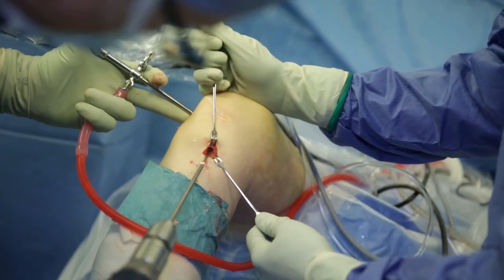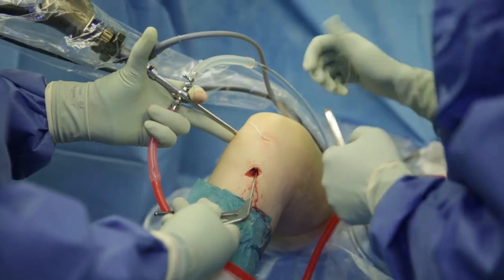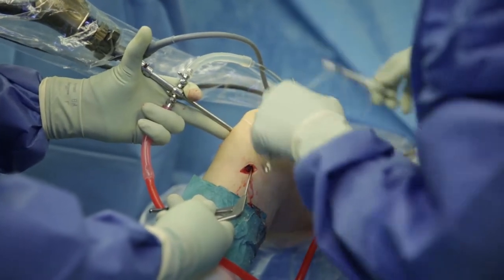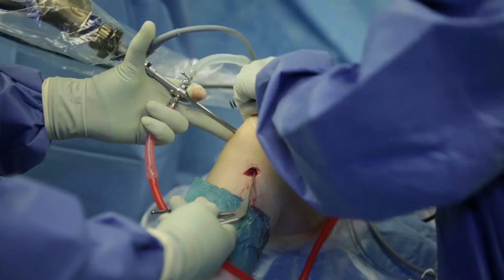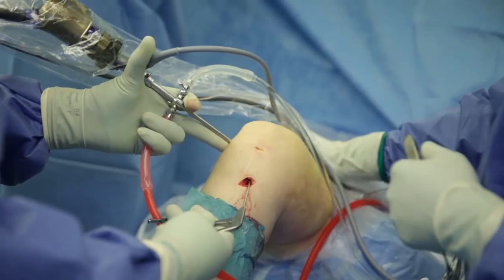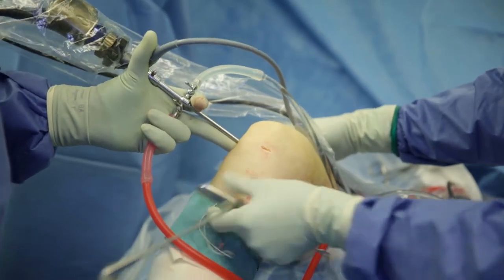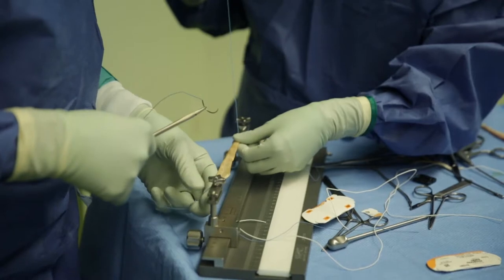So now we shuttle the sutures for graft passing. Here you see the standard graft preparation.